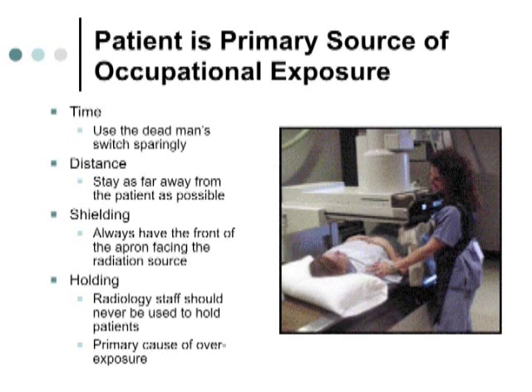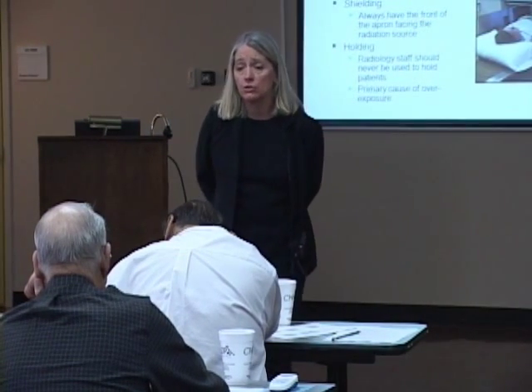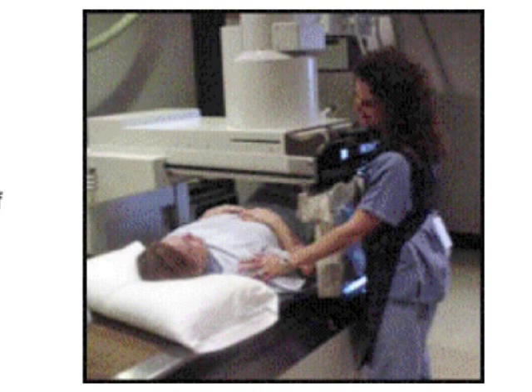And then shielding. How many of you have aprons that are open in the back? Or do you have wraparounds? Most places have wraparound aprons now if you're doing special procedures and that sort of thing. The only bummer about wraparound aprons is they're heavy, right? So they come with waistbands that you can use that take the weight off of your shoulders, but of course they weigh twice as much as an open back apron like this one.